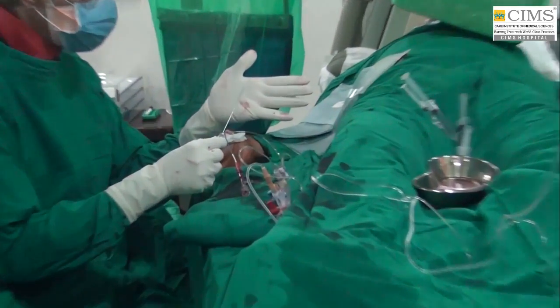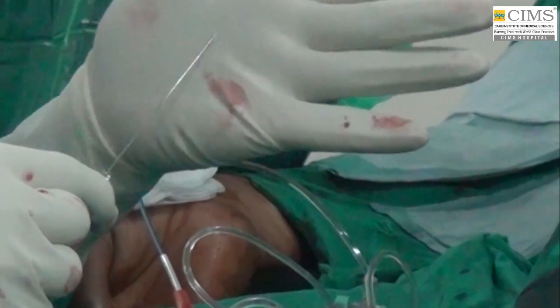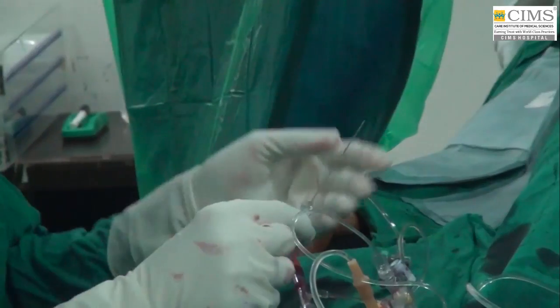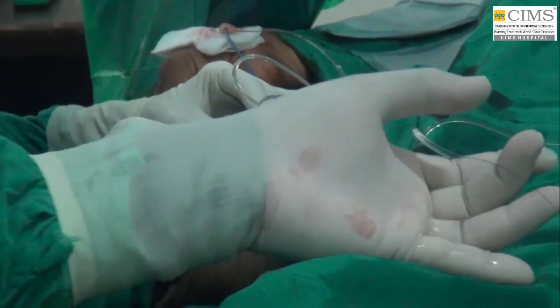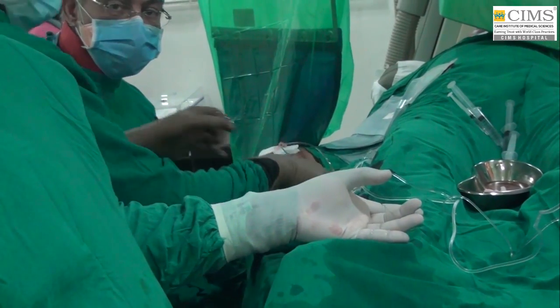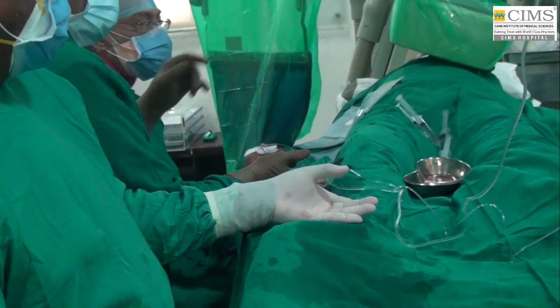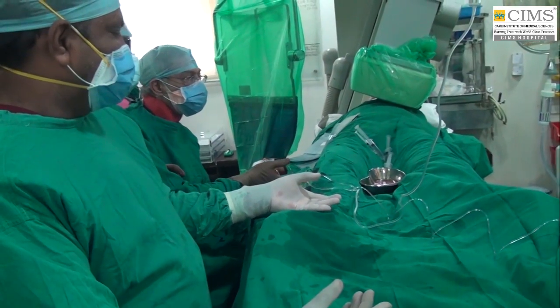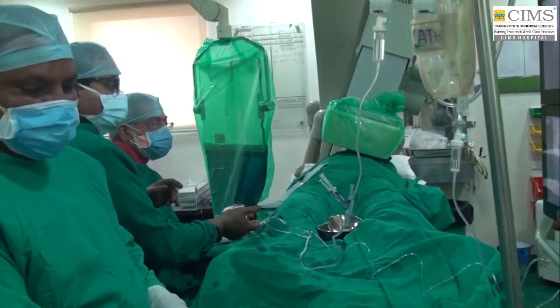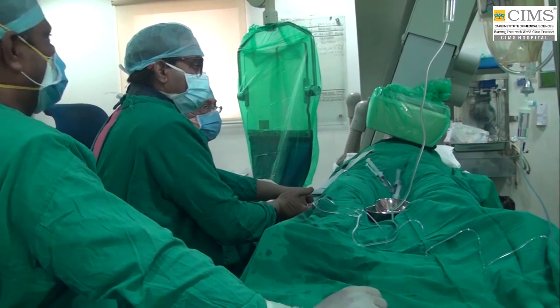I like to bend the wire usually with a slight acute angle, 45 degrees. So that's what I'm doing, Dr. Vineet. So the wire has a nice bend, but a fairly sharp bend, which makes it more torqueable than the gentle curve people are used to making. So this kind of bend, you make it in all the lesions, or depending upon the lesions, you make this curve? I always make this sharp angle, 45 degrees. Only the tip length differs.